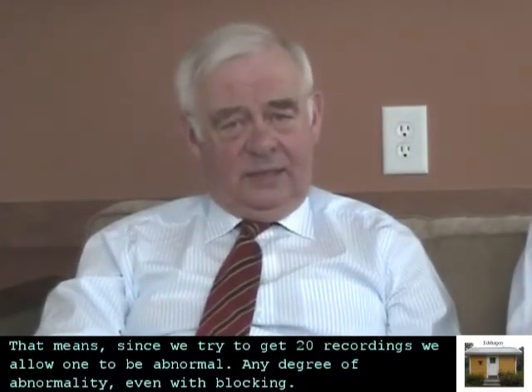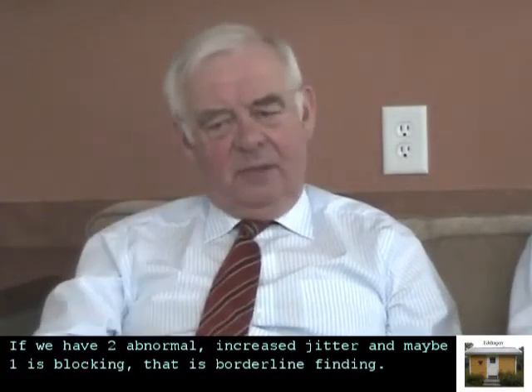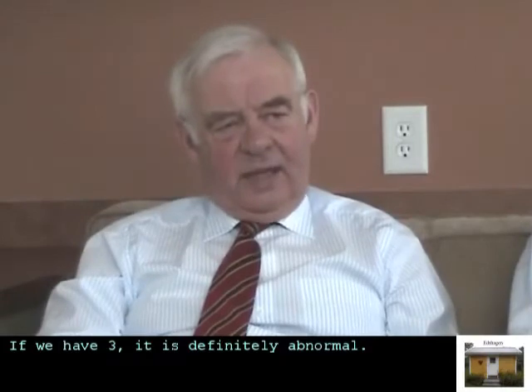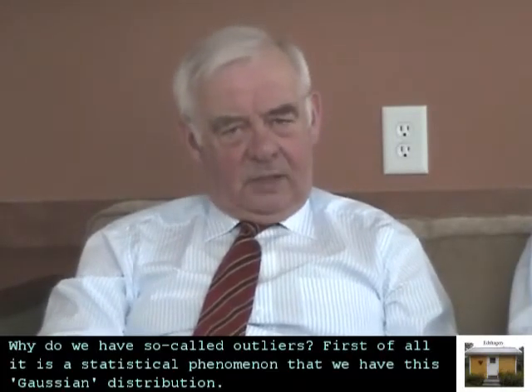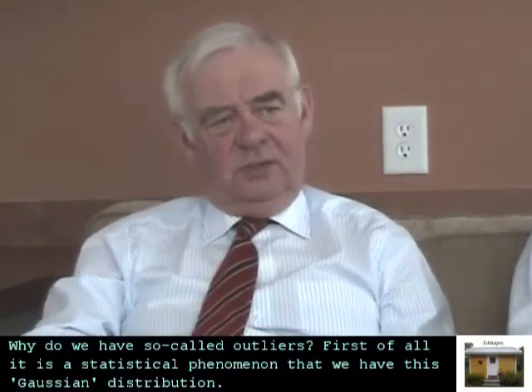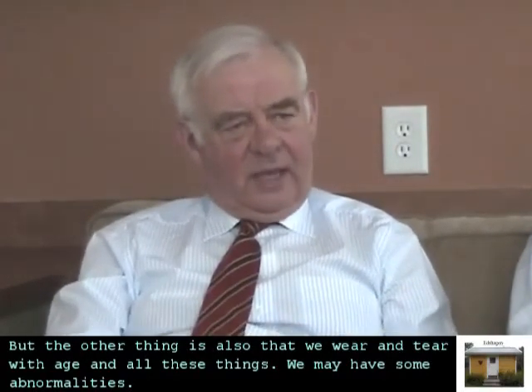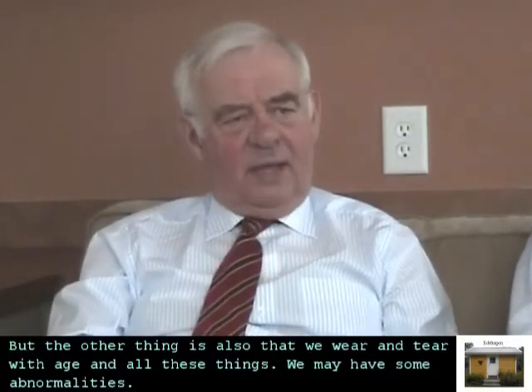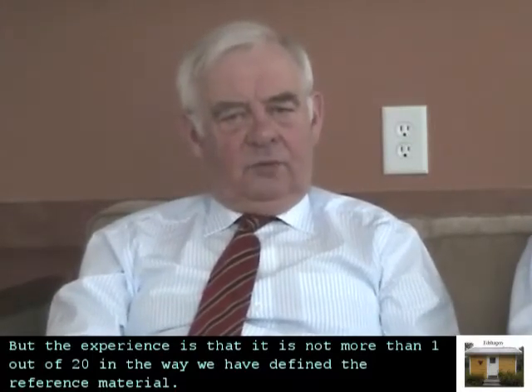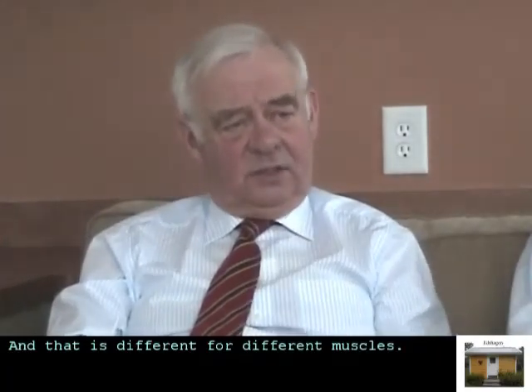Any degree of abnormality, even with blocking. If we have two abnormal increased jitter and maybe one is blocking, that is a borderline finding. And if we have three, it is definitely abnormal. Why do we have so-called outliers? Well, first of all, it's a statistical phenomenon that we have this Gaussian distribution. But the other thing is also that with wear and tear, with age and all these things, we may have some abnormalities. But the experience is that it is not more than 1 out of 20 in the way we have defined the reference material. And that is different for different muscles.